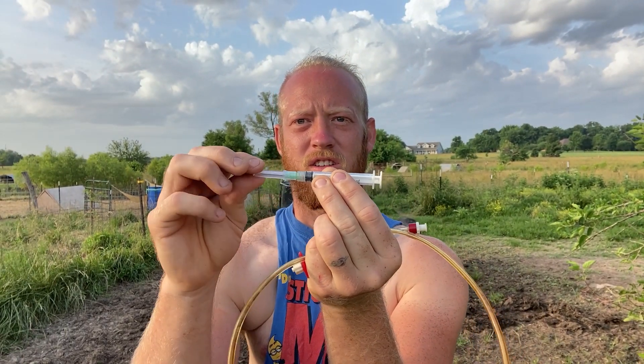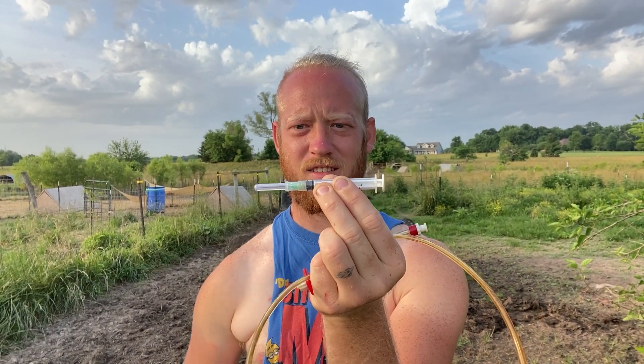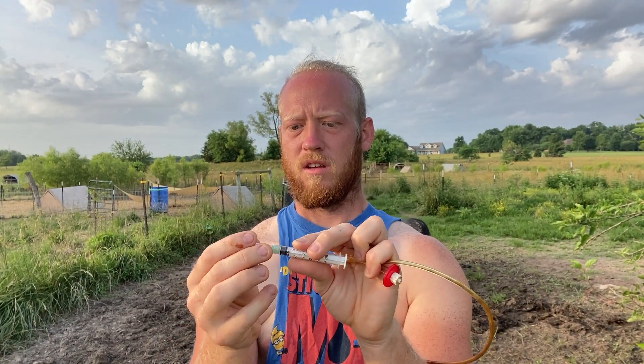So normally you're gonna have your syringe and your needle and you'll just thread it on like that — twists on, cap pops off. For a slap shot it's pretty much the same thing except your syringe comes back here on the piece that looks like the needle head. Threads on. And then on that other end that looks like a syringe head, that's gonna twist on.